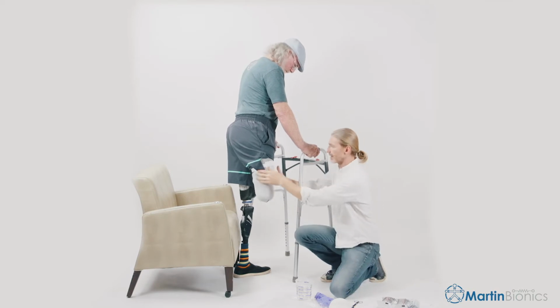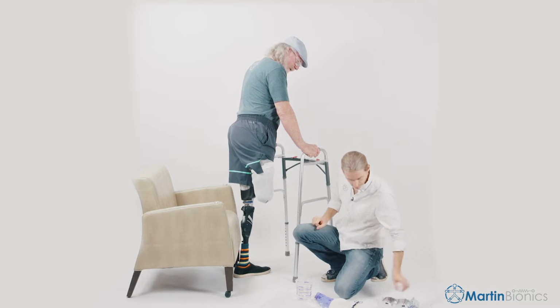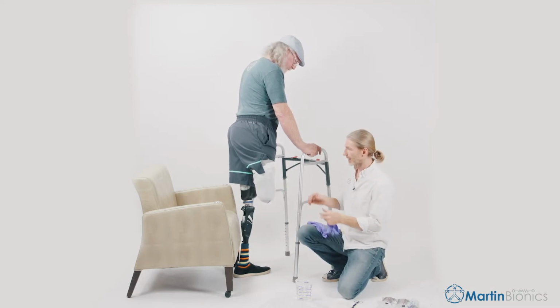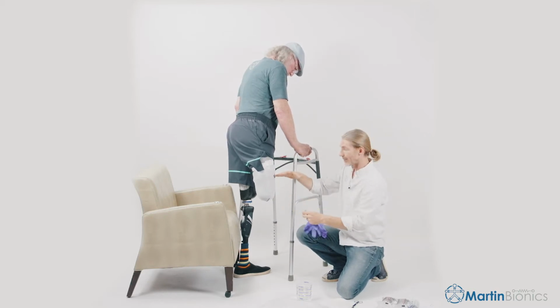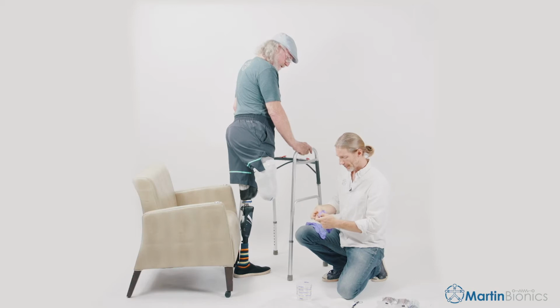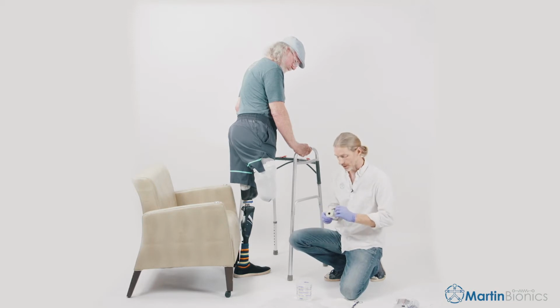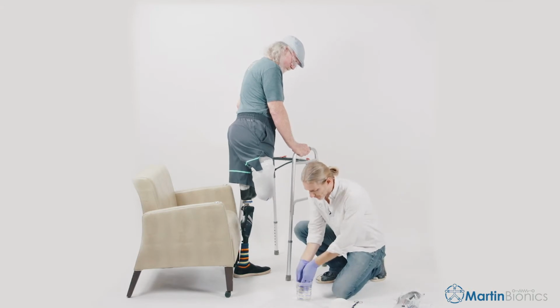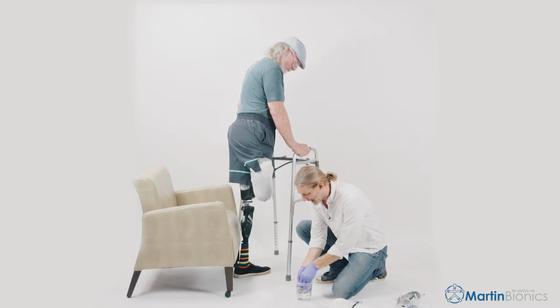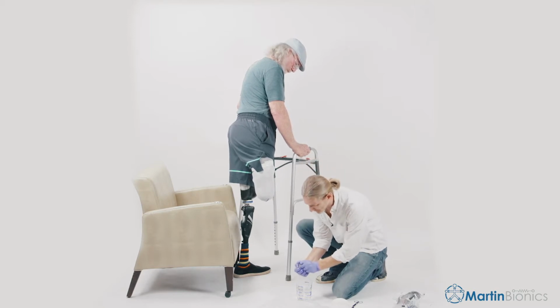We could do this casting in sitting or in standing on this first section because we're literally just casting the distal half of the limb. Now when I take these casts, I take the length of the limb from the groin level to the distal end, bisect that in half, and I'm just going to cast that bottom half. I like to use the 3M soft cast material for this first cast. The dynamics of this material are very similar to a ProFlex inner socket. And so this initial cast will be the functional equivalent of a ProFlex inner socket as a check socket phase.